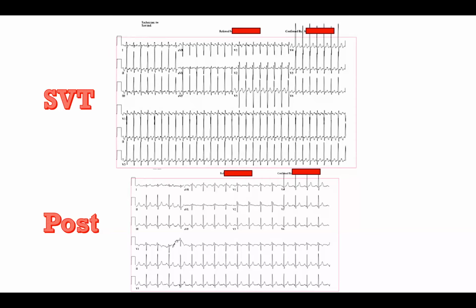But if you can't tell and you're guessing, certainly the heart rate being 190 and the fact that it's an adolescent, from a population-based approach, averages, you have a good shot of getting that right.